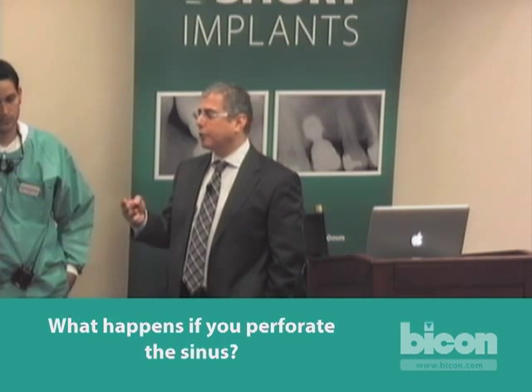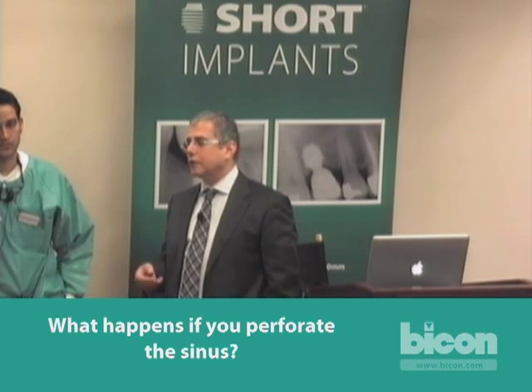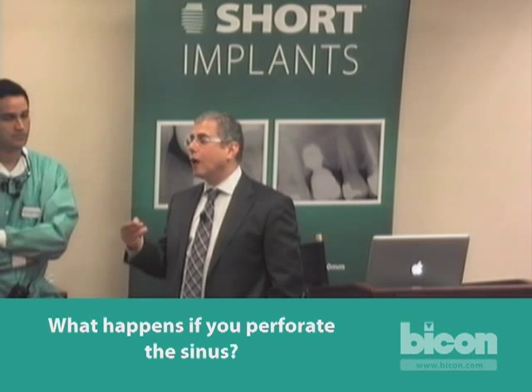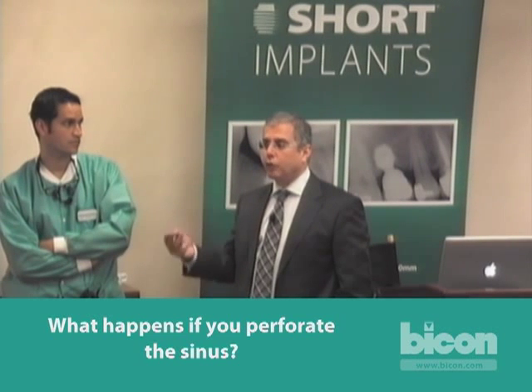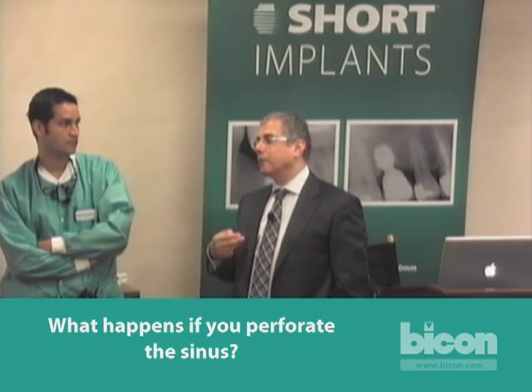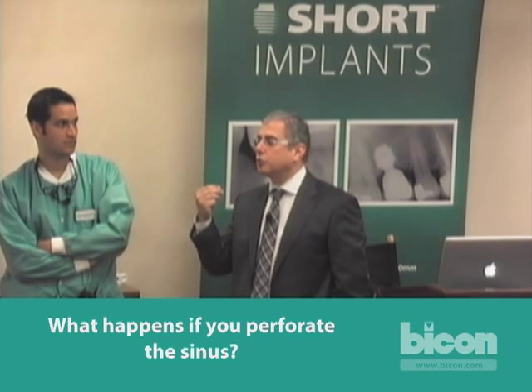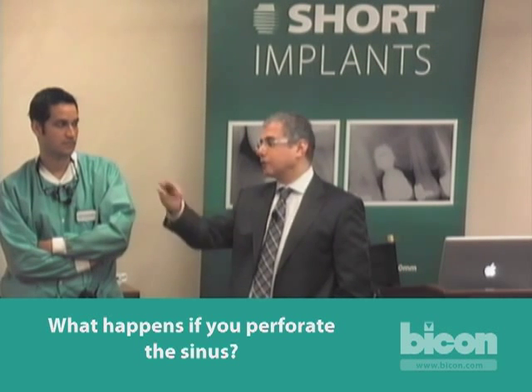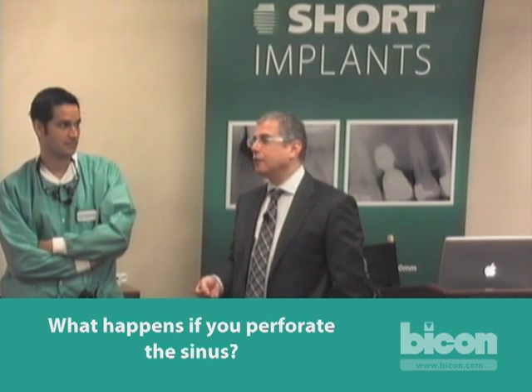The best way to treat a perforation is not to have one in the first place — measure twice, three, or four times. Do whatever it takes to avoid that. If you have a perforation, the second thing you have to do is know that you have a perforation. So before you proceed, look at all the signs: excessive bleeding, bubbling from there. If you have a big tear, you can feel that there is no resistance as you introduce your graft — if your graft just flies in and keeps going and isn't giving you any resistance, that's a dead giveaway that you have a tear.